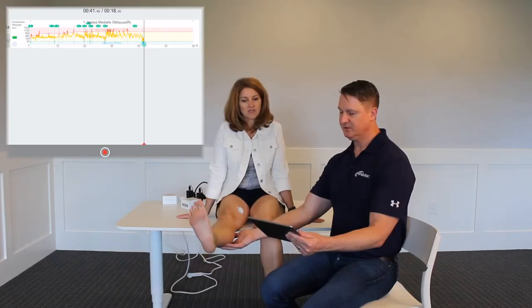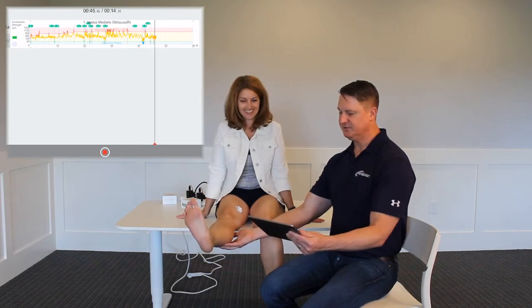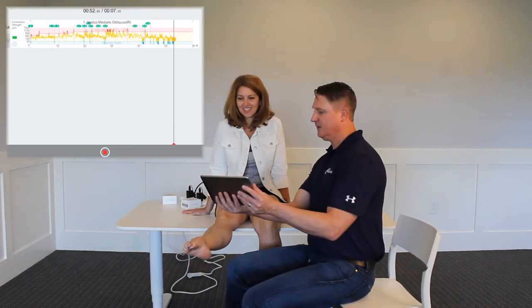We've got 20 more seconds. Take a break — great. Now flex the foot again and really squeeze the vastus medialis. Great — you can see that feedback.